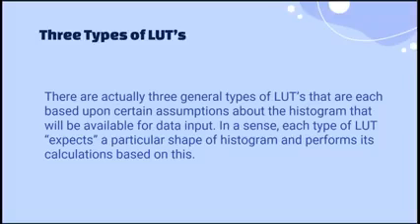During image processing, we have two LUTs or lookup tables. The first LUT is the one that we acquired or processed, and the second is the one that is preset, pre-made or installed by your manufacturer. The first LUT that we acquired should match the LUT that is preset by your manufacturer, so that processing errors will not occur and the images are of great quality.